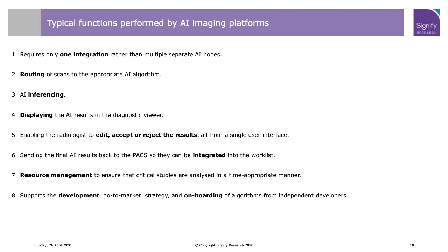The platform is also able to manage resource and ensure that critical studies are prioritized for analysis. It may also support users in developing and onboarding their own AI algorithms for use. As more imaging AI platforms come to market and become more integral to the imaging workflow, the number and the complexity of these functions that they are able to offer will no doubt increase.